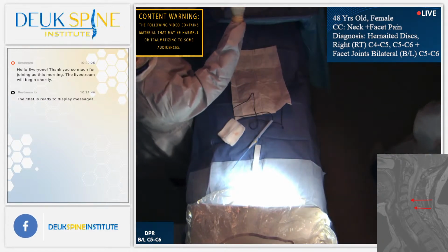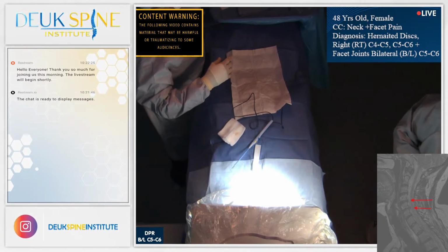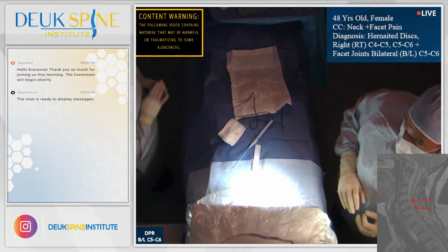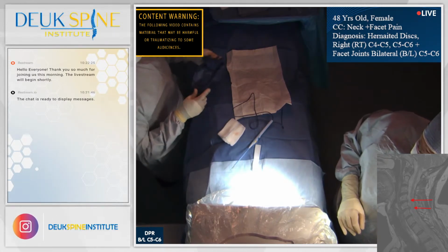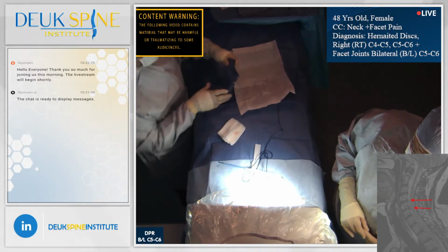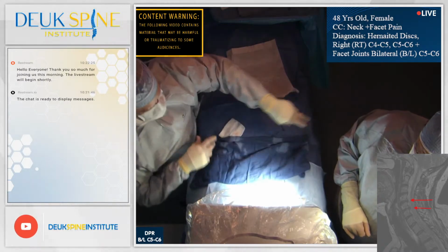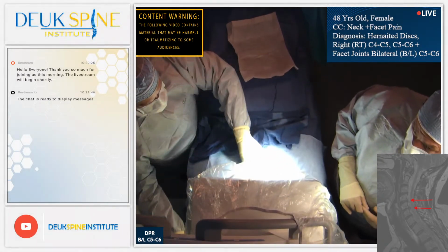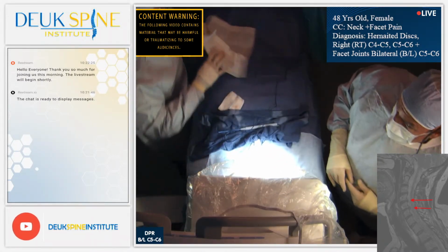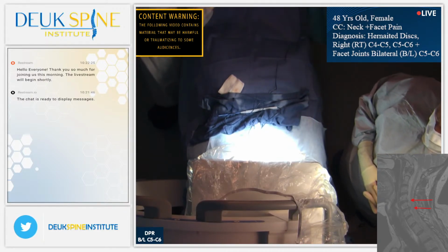It's Thursday, September 19th. Our first patient has cervical facet joint pain. She injured her neck years ago, and she's developed arthritis in the facet joints. We're going to show you what that looks like and why it happens in just a moment. She is intubated because she's having her laser surgery done right after the facets. So on the x-rays, you're going to see an endotracheal tube and an esophageal temperature probe.